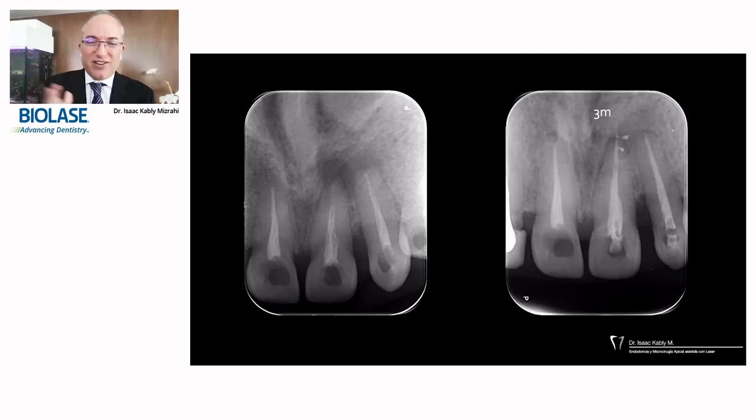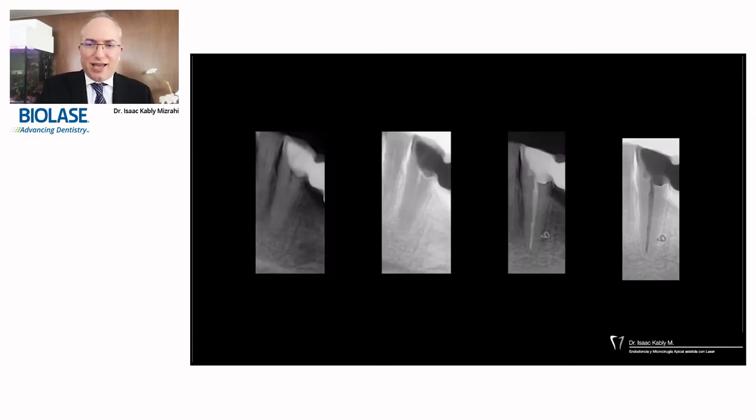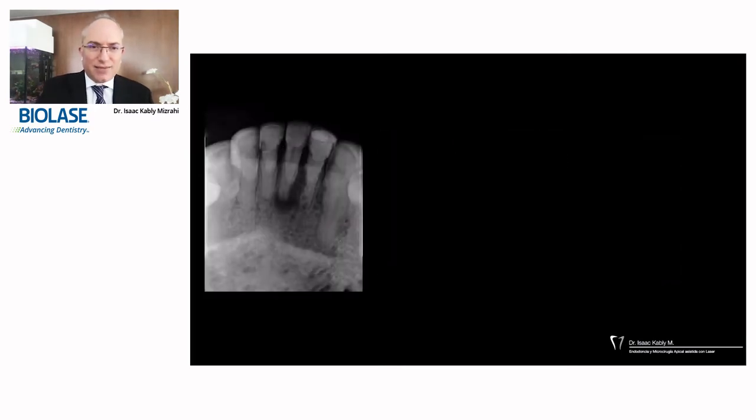I mean, we get them here, and I love to get them, but I want you to see this bone healing here after just 3 months in a patient who was in pain and just wanted to get the proper treatment in order to get going. If we put an example of this lower canine, we can see that at the beginning we had this lateral lesion, and we were expecting some of the cement to go through that lateral. And you see this on a daily basis.